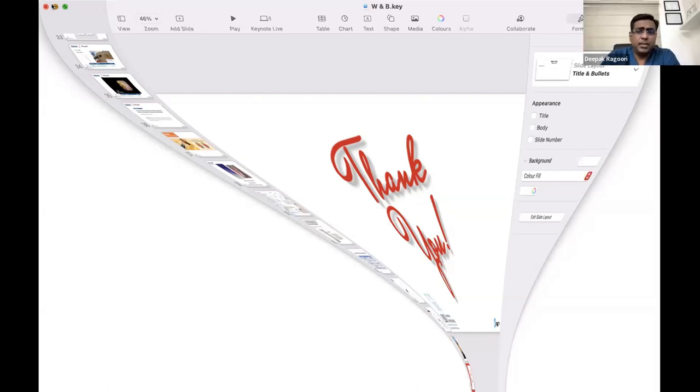Yeah, again, as far as PCNL is concerned, if you tend to use a flexible nephroscope to retrieve stones through a percutaneous tract, obviously you would be using a basket, especially because you wouldn't use a rigid instrument through a flexible scope to pull out. But that is where your open-ended baskets come into the picture, or large volume zero tip baskets. These are the two favorable choices. And yes, especially in a tricky PCNL where you are going through an inaccessible calyx with your flexible nephroscope, an open-end basket is a perfect choice.